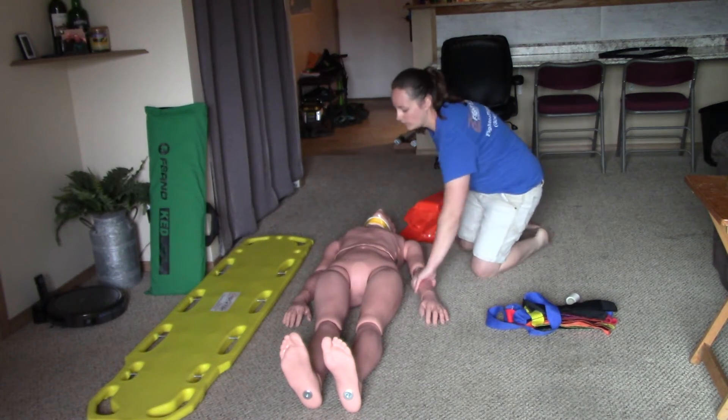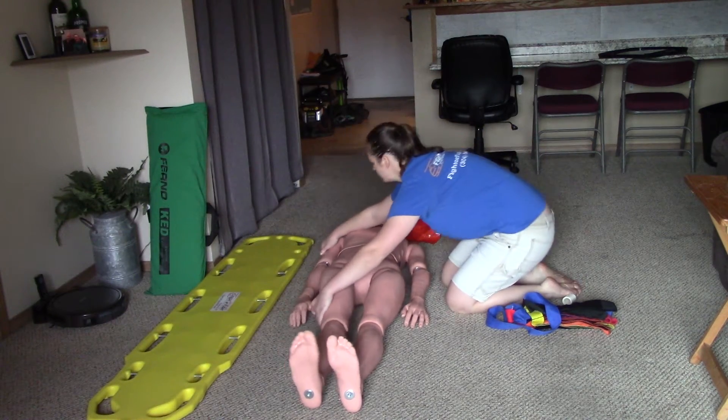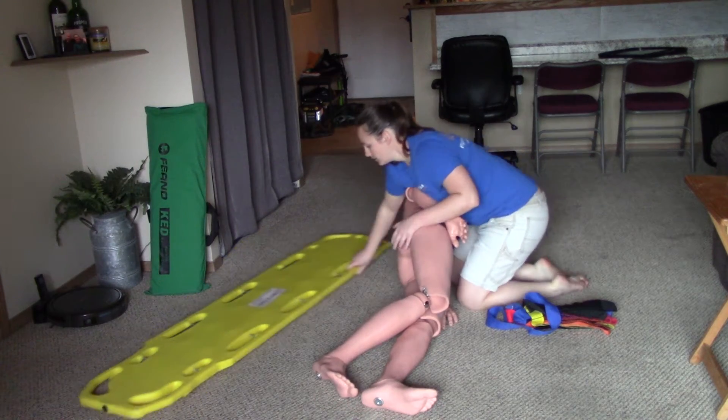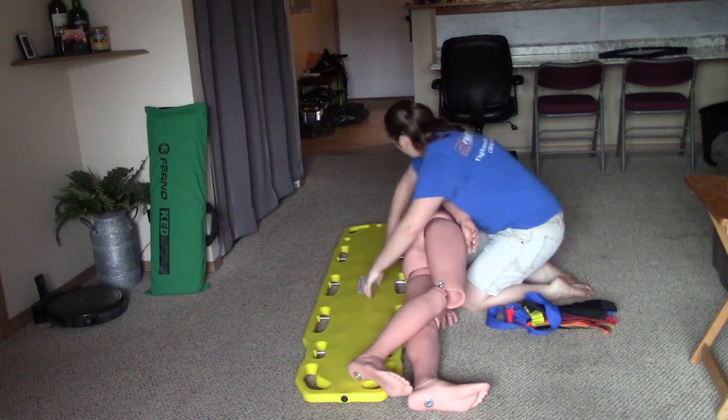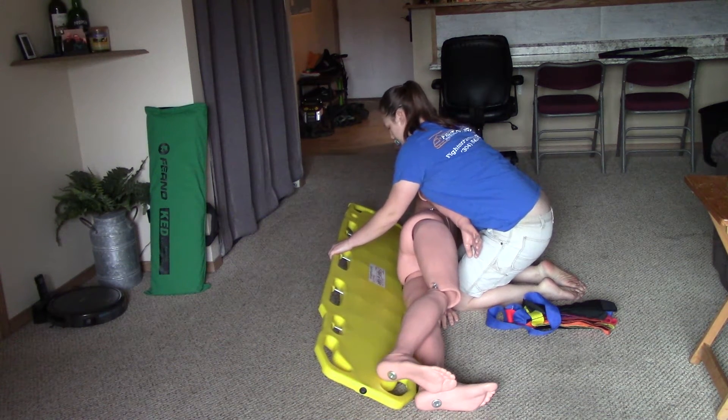I'm now ready to log roll my patient. Log roll on three — one, two, three. Slide the backboard under the patient. On three — back down: one, two, three.